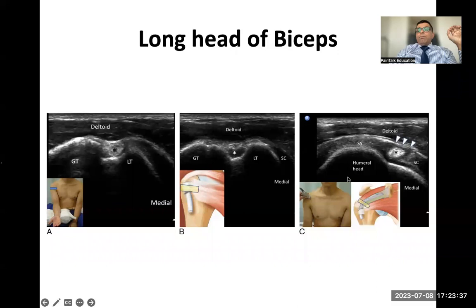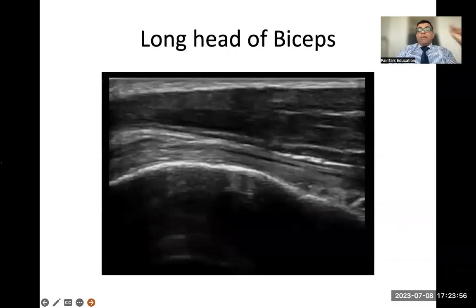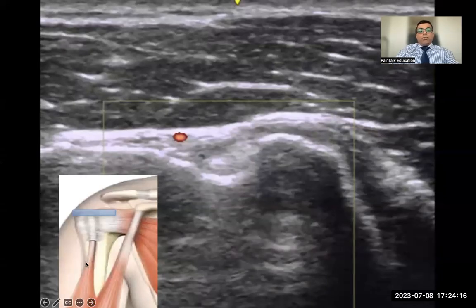This is the intra-articular portion of the biceps tendon at what we call the rotator cuff interval — you start scanning here and move up to see the biceps tendon becoming intra-articular, between the supraspinatus and subscapularis muscles. Always put on color Doppler — it's very important to look for the anterior circumflex humeral artery branch. You don't want to inject into this artery.